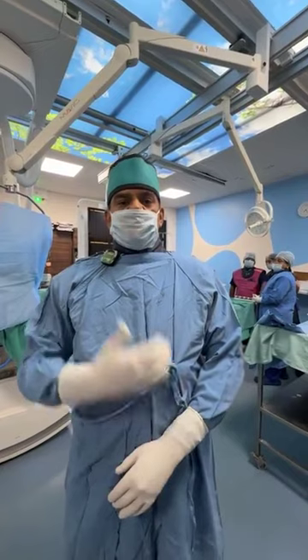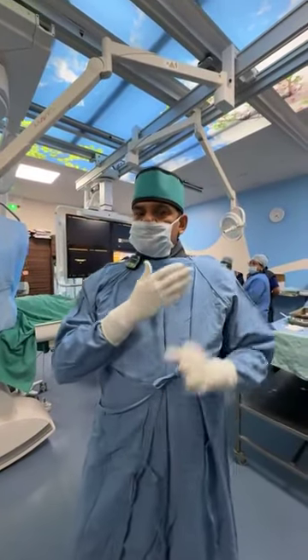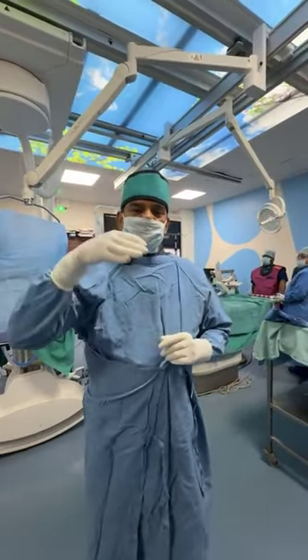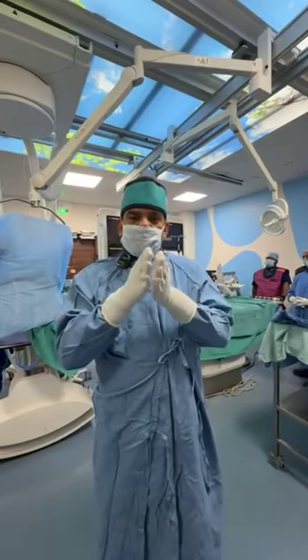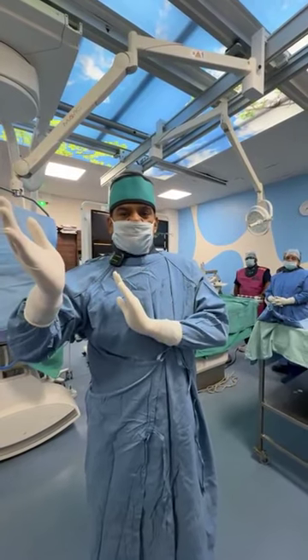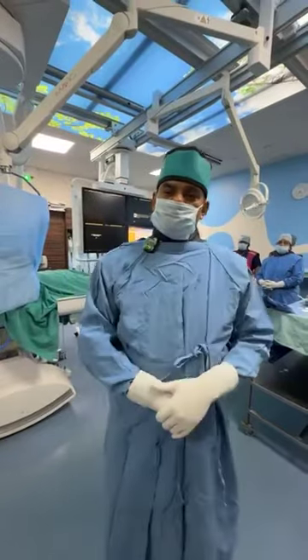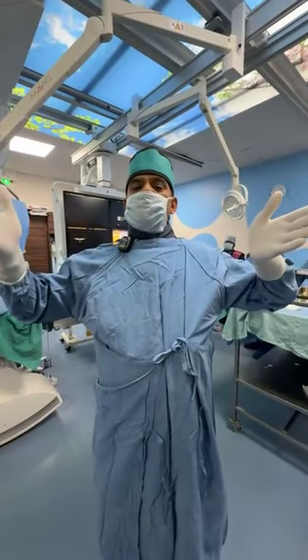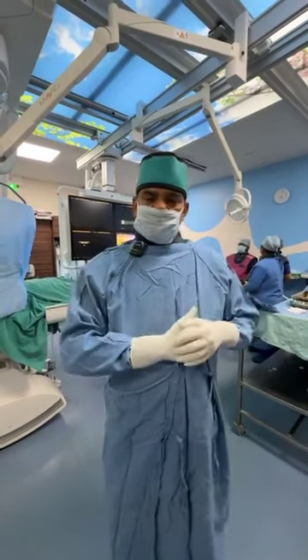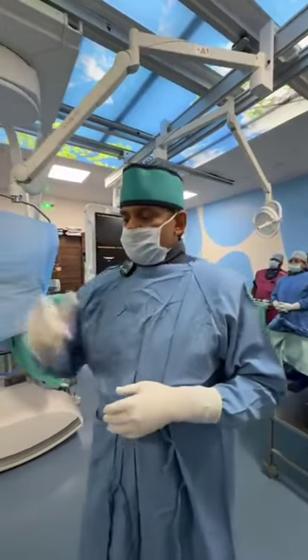And now here the dissection has just started at the level of the left subclavian artery. Dissection means this large tubing has multiple layers inside it. So the blood has dissected and it has separated the two layers of this tubing. And because the false lumen is having only one single tubing, it has a very low pressure, the blood starts gushing into the false lumen. The false lumen continues to become large, and the true lumen gets compromised, and this is what is happening here. And we will go and do an angiogram here first, then we will start doing the graft.